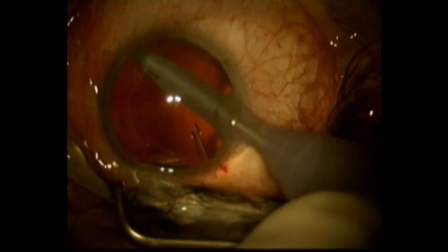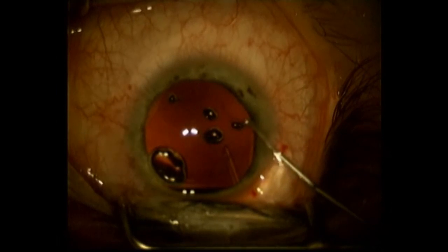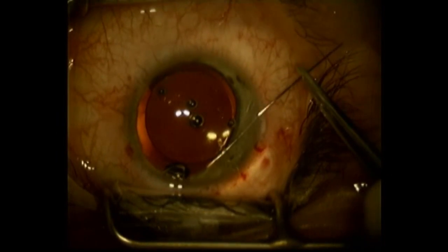The perfect cataract operation removes 99% of the cataract and then puts in an intraocular lens. Here I'm doing a little bit of synechiolysis in preparation, then putting in a loop-designed acrylic lens into the capsular bag — here I'm using the STC-6.